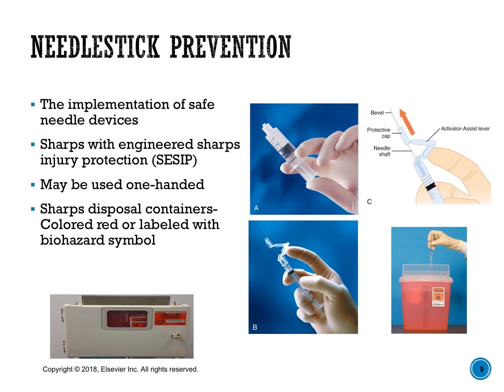Additionally, oftentimes what you're going to end up doing, because when we use an IV push, the saline lock or the IV tubing has needleless connectors, so you're going to end up removing the needle from the actual syringe and just putting a cap back on. It's going to be a needleless thing. Make sure when you go in the patient's room, when you're scanning your environment, you're looking to see where the sharps containers are so that you'll know where to get rid of your supplies.